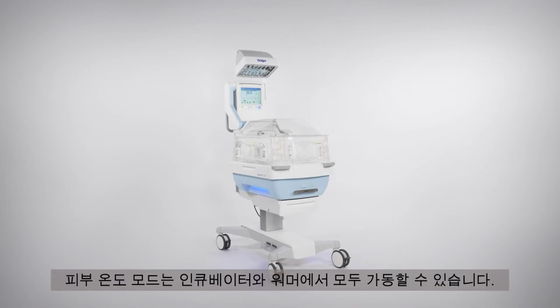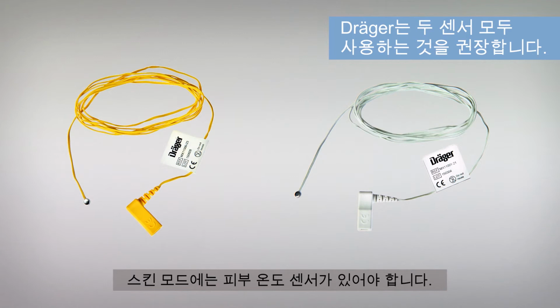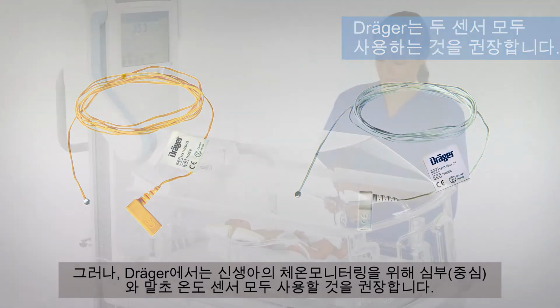Skin temperature mode can be activated in both incubator operation and in radiant warmer operation. The skin mode requires the use of skin temperature sensors. You can operate at minimum with only the central skin sensor connected. However, Dräger recommends using both sensors, the central and the peripheral, for thermomonitoring of the baby.